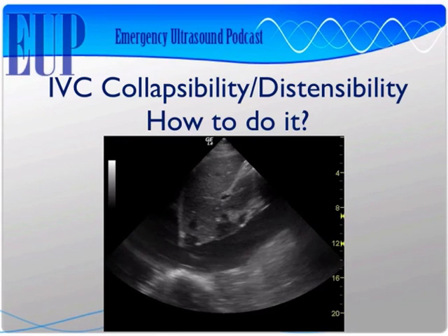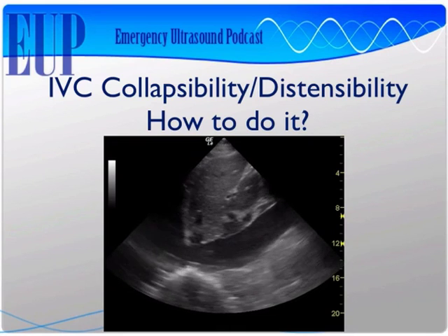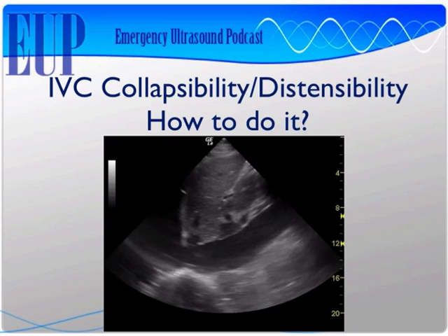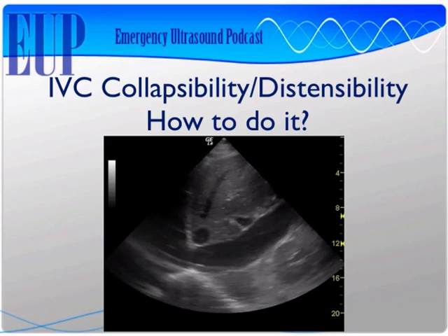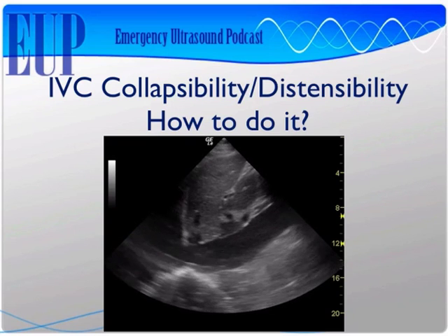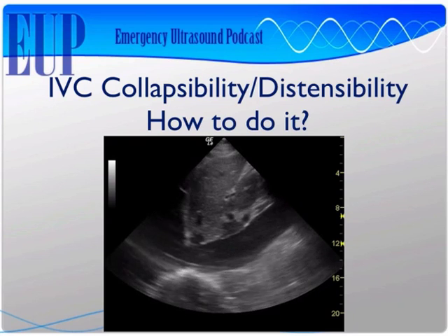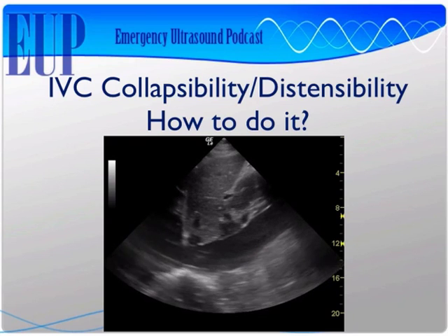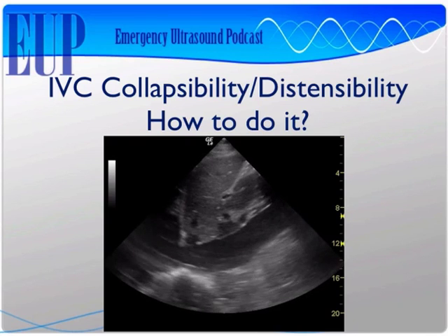And then here's a different IVC. This one's clearly larger. There's hardly any respiratory variation. So this is a good example of a big dilated IVC in somebody that's got a lot of fluid on board, or at least a lot of backup of fluid from the right heart. But if you think about this, Matt, this IVC is huge. So I can make two assumptions here. I could assume that either the patient's volume status is way up, or I can assume there's something really wrong with the right side of their heart.